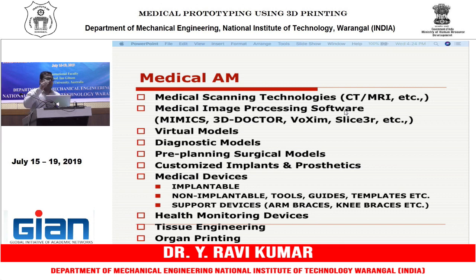If you take a particular slice, it consists of bone, soft tissues, liquids, or different white matter or anything, but you may be interested at a particular point of time in a tissue or some region of interest. So then you must have some medical image processing software to do that. For the segregation, we need some kind of medical image processing software.